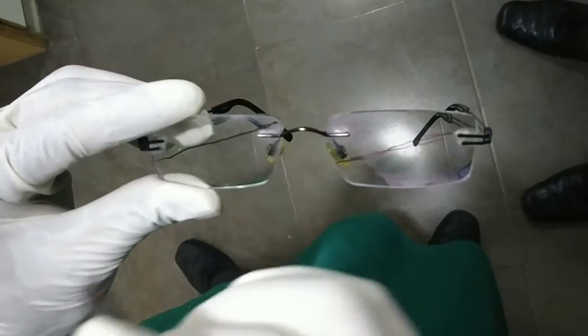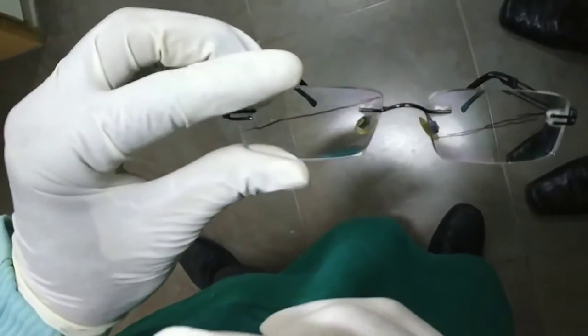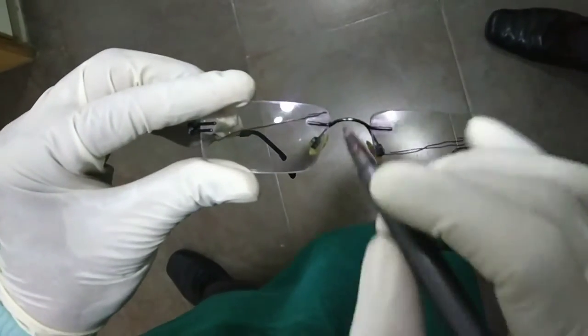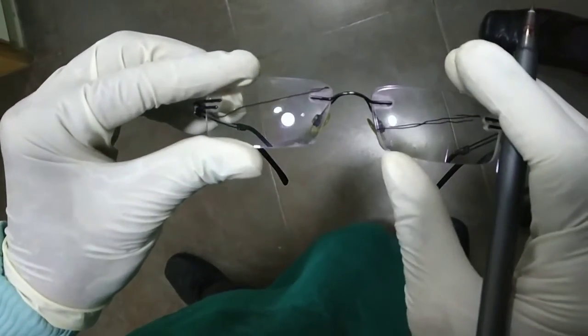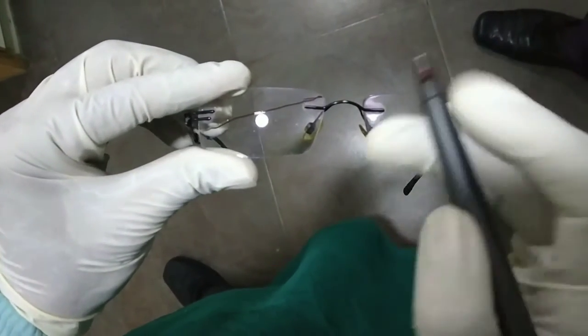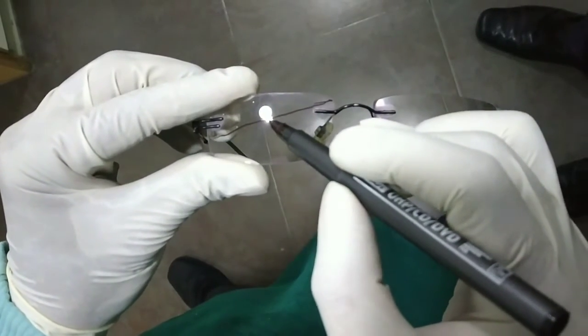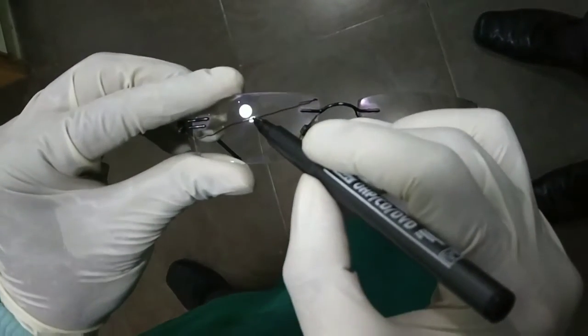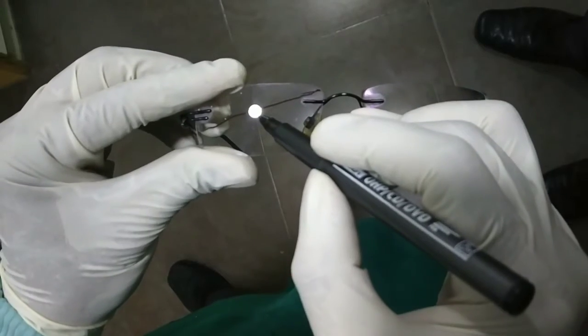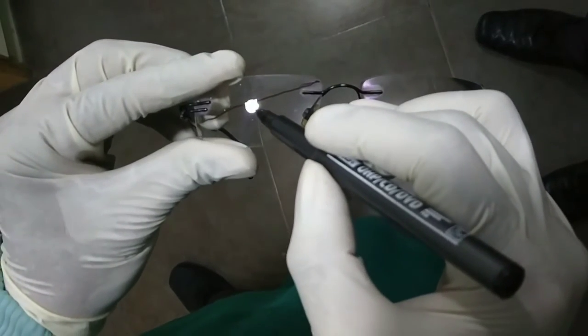After that, we will check the centration. To check centration, we have to see these two lights. You can see two reflections from the above light source. You have to exactly align the center. You can see the back reflection, a smaller one, and a big reflection from the upper one. We have to align it very properly.